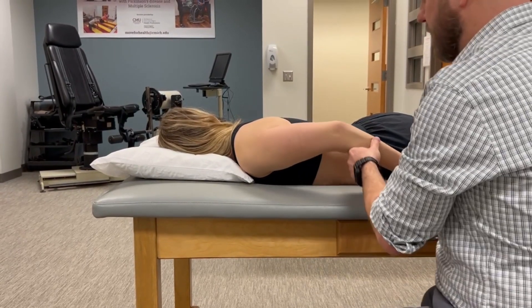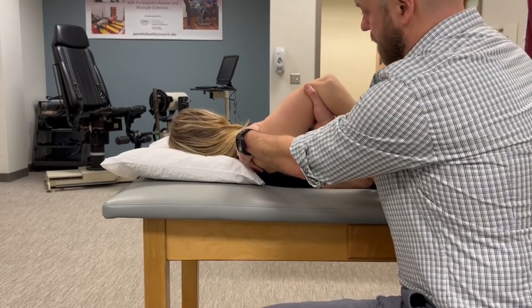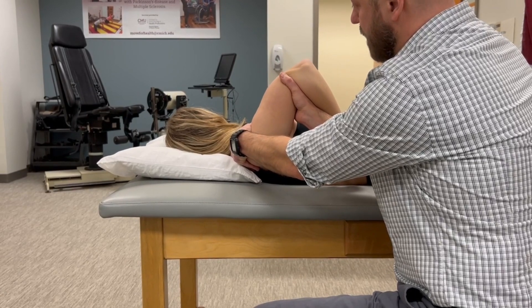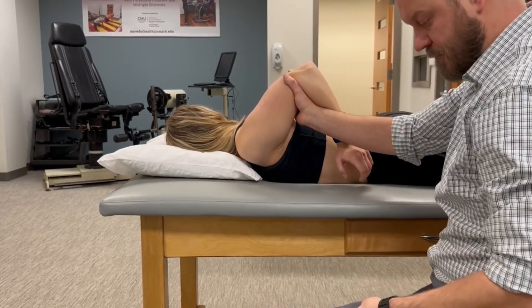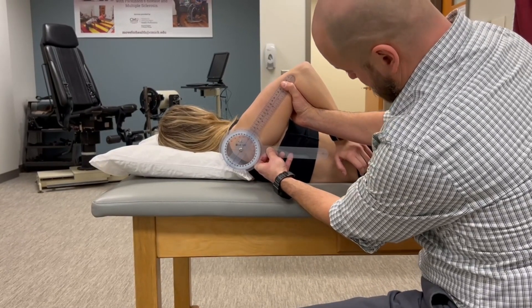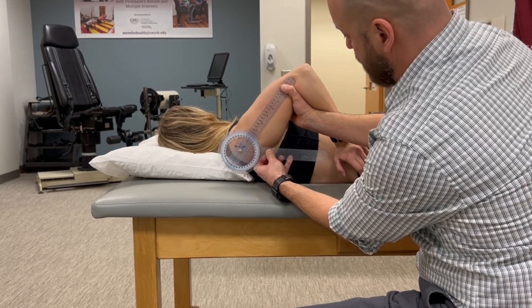You can also measure this passively in this position. Again, we want the elbow to be flexed. Extend to the end range spring barrier. We can estimate our range to be about 60 degrees or so. We're going to use those same landmarks of the lateral midline of the trunk and midline of the humerus.